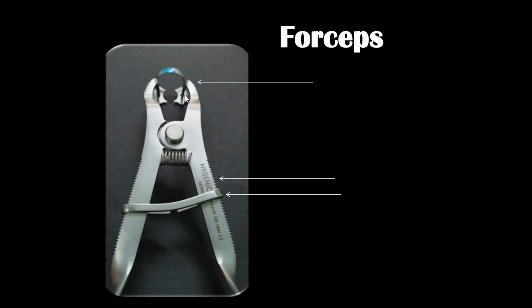That's a big advantage because when new users start using clamp forceps on the clamps, they tend to overexpand the clamps. When you overexpand the clamps, thinking that you will engage the buccolingual width of the tooth easily, you're actually putting too much pressure or load, stresses on the spring-tempered steel, and it might lose its springiness and it will be a waste. The clamp will not engage, there will be no tension. So the delicateness of the beaks will ensure that you will not open it too much because it will not open beyond a certain point.